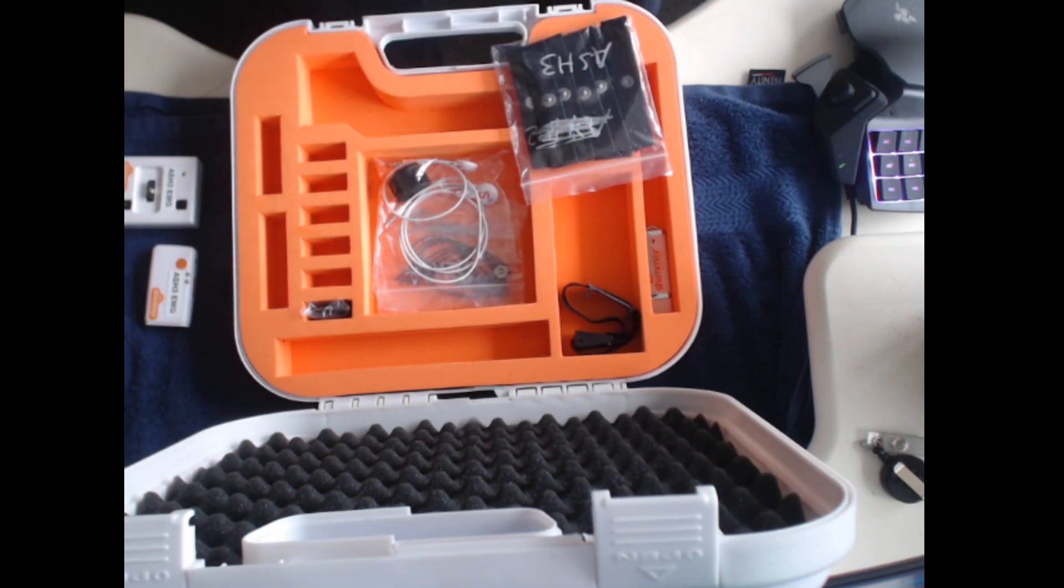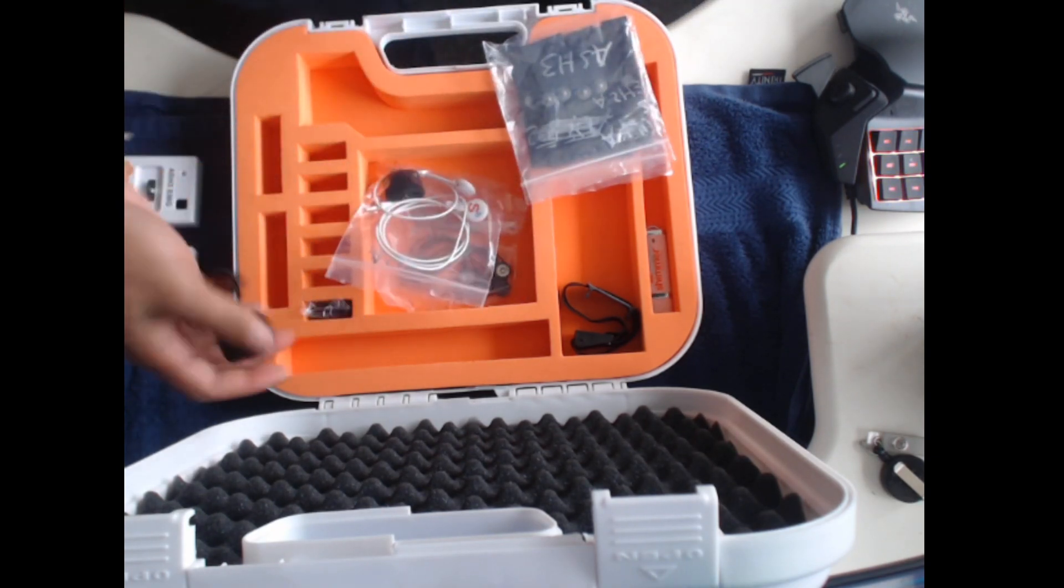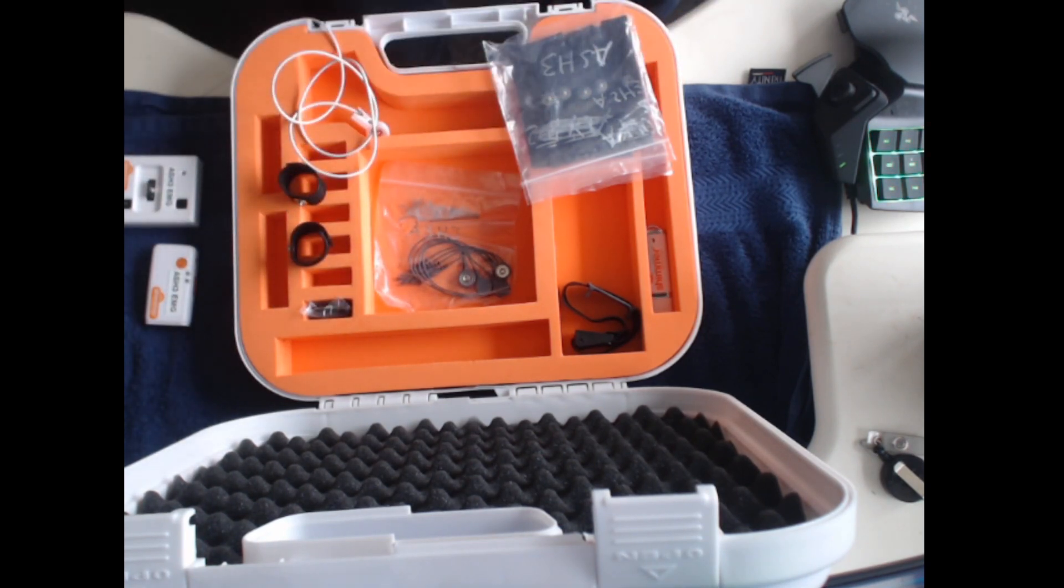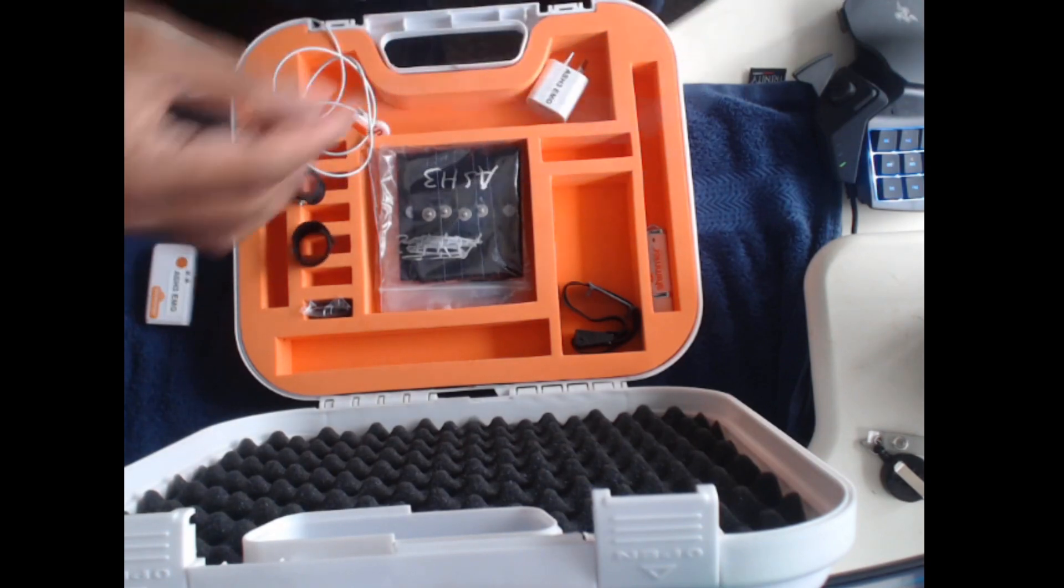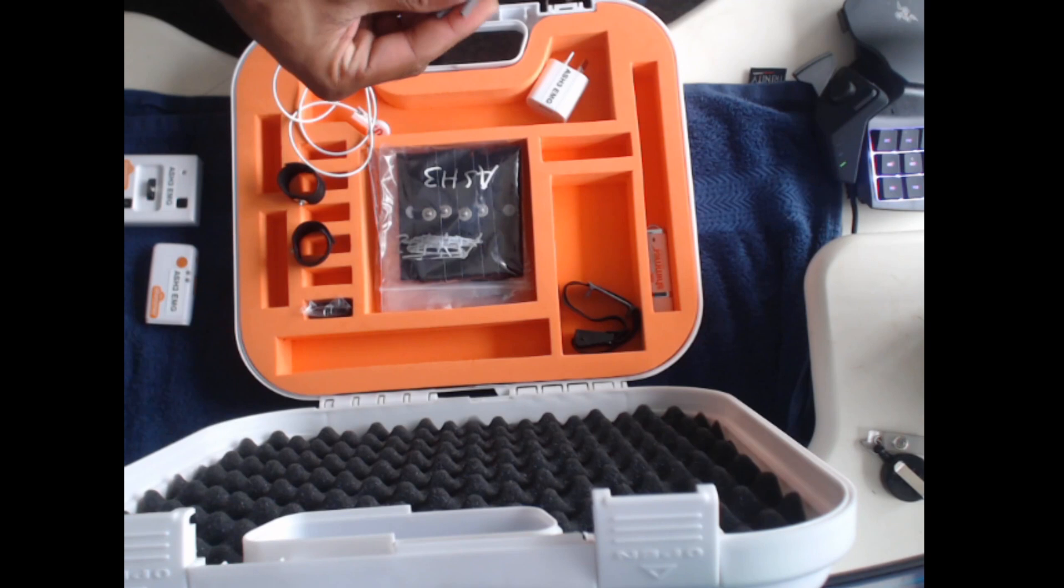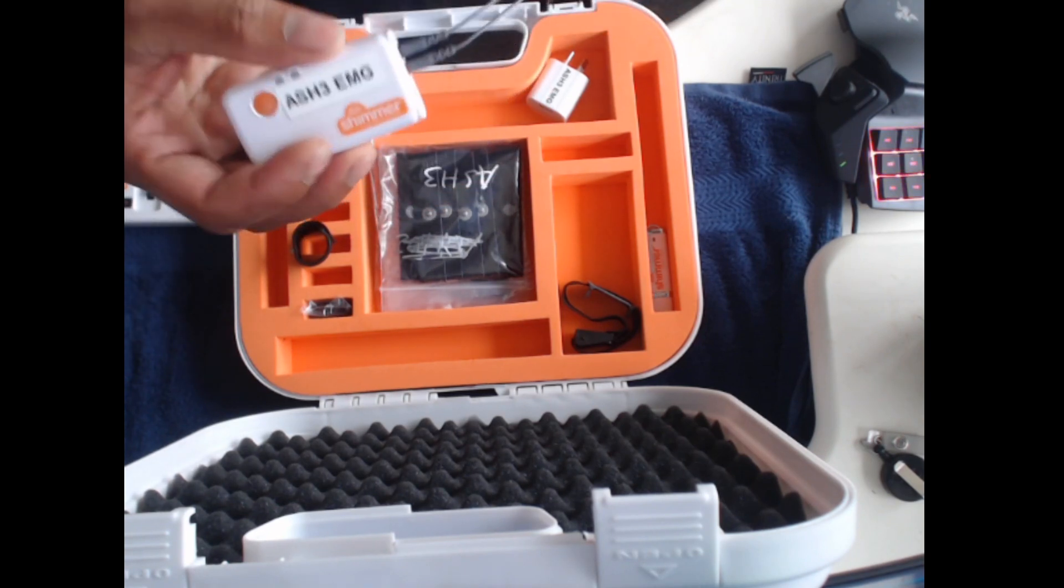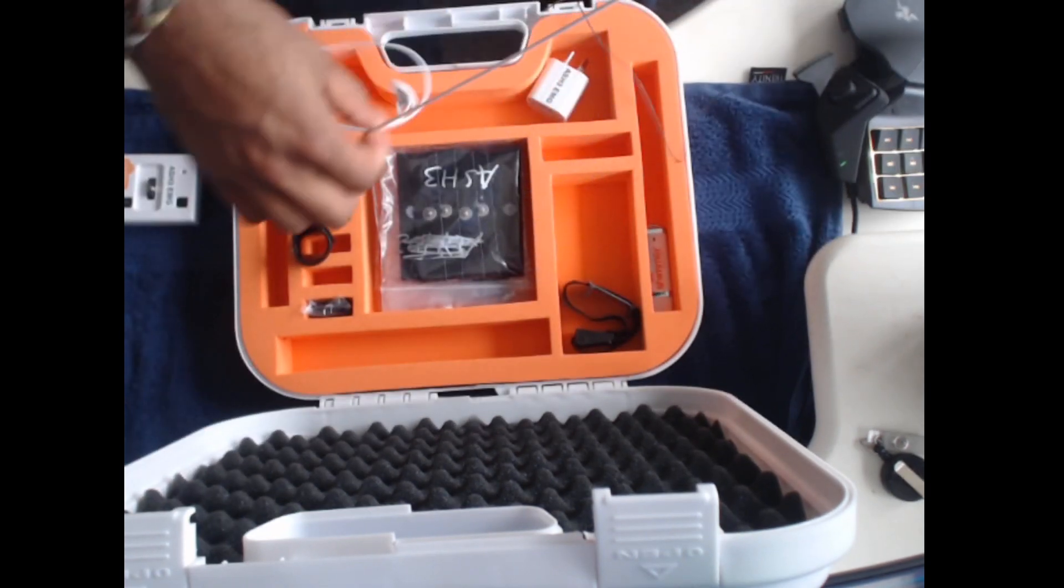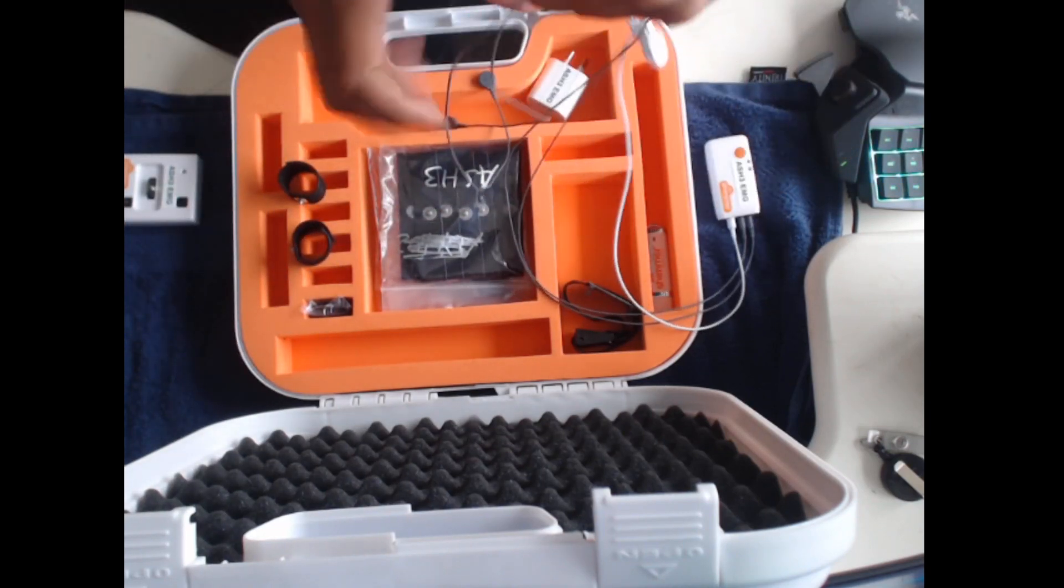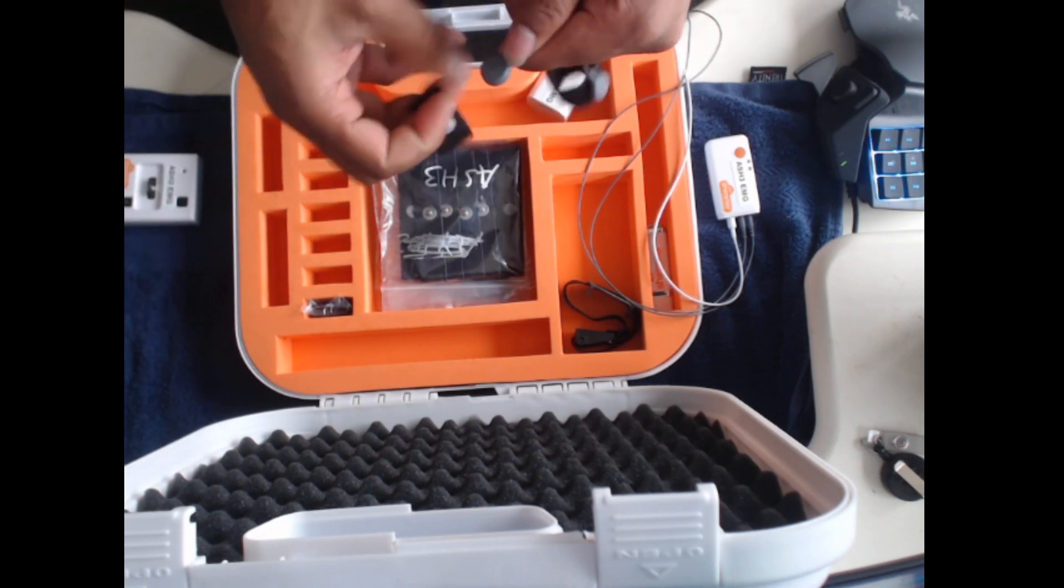We have the optical pulse probe which is used to get PPG information. We can calculate things like heart rate from the PPG information. Take the leads and plug them into the Shimmer sensor. The optical pulse probe is a 3.5mm jack. The other end of the biophysical lead can attach to the GSR electrodes.